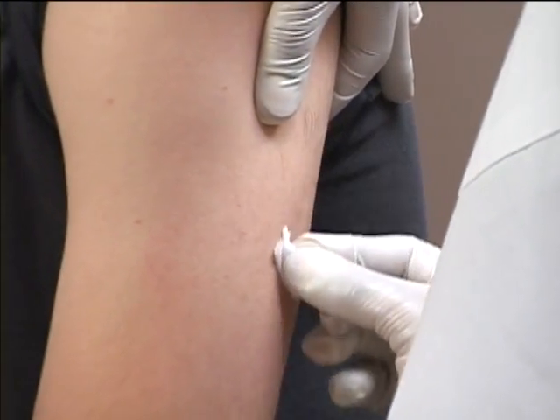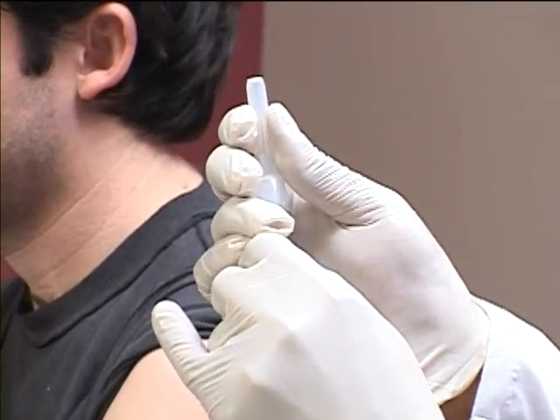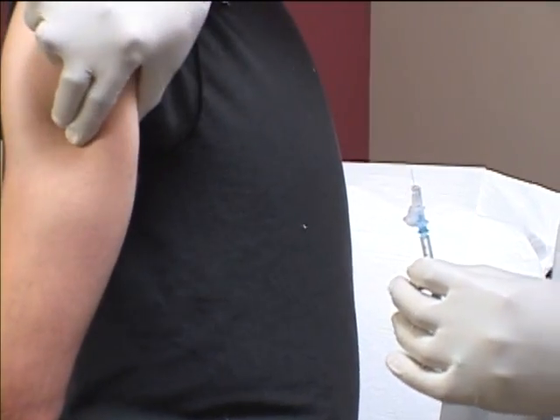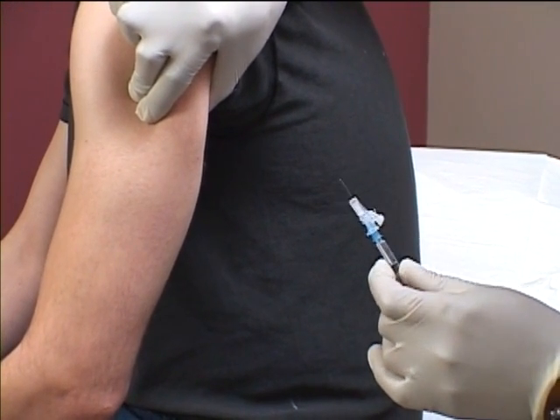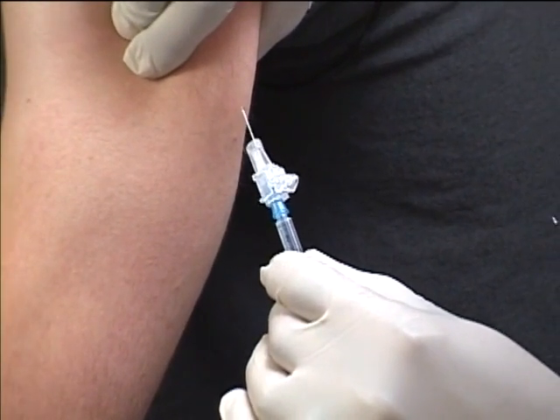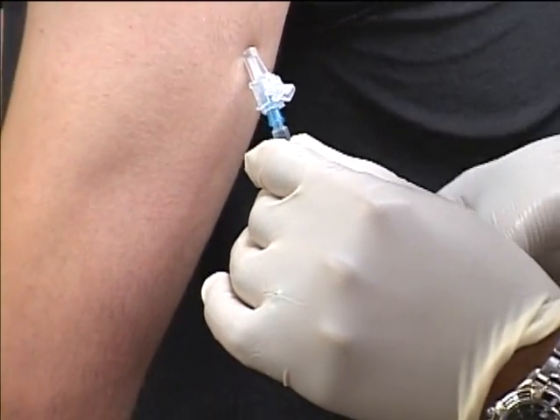Use an antiseptic swab in a circular motion to clean the skin at the site and allow it to air dry. Remove the cap from the needle. Pick up a cotton ball with the other hand. Pinch the skin to elevate the subcutaneous tissue and hold the syringe between the thumb and forefinger of your dominant hand. Inject the needle quickly and firmly, using a swift motion at a 45-degree angle, then release the skin.